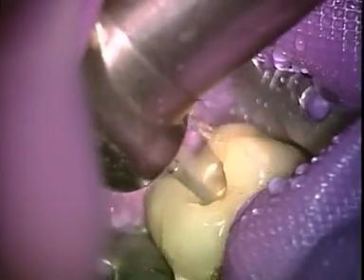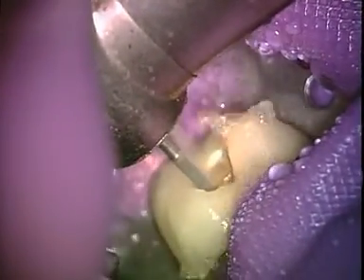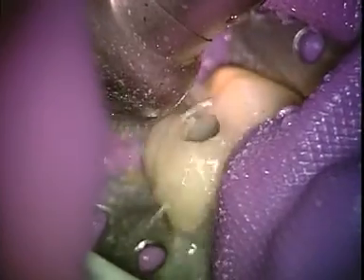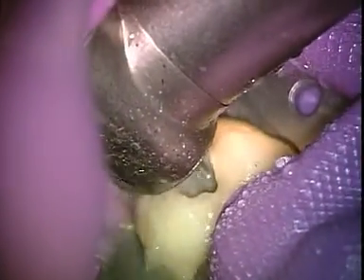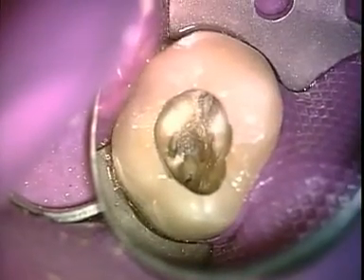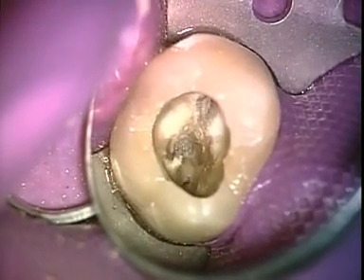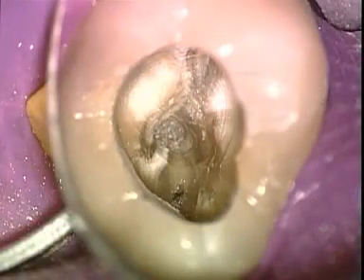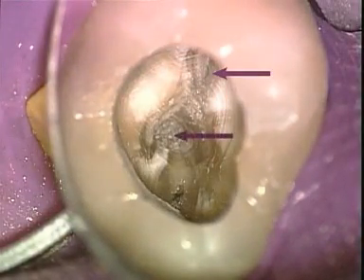The crown is open to provide access to the root. In view of the crown, the access cavity must be kept as small as possible, but still be as big as necessary. The root canal entrances are now visible. 3 of the 4 root canals are clearly distinguishable. The 4th is situated too far palatinally.